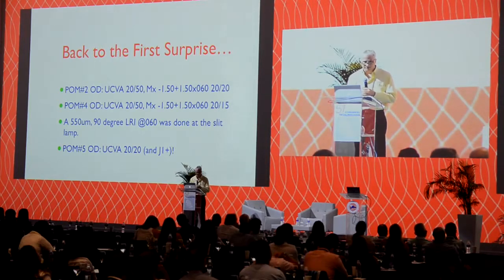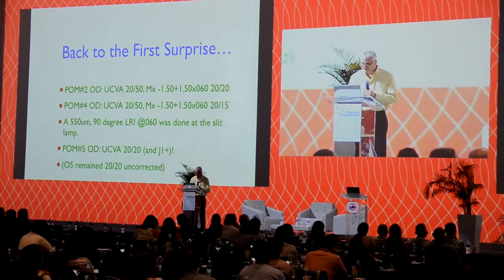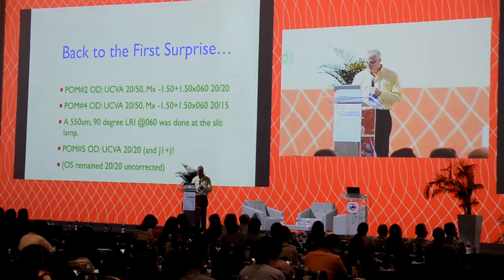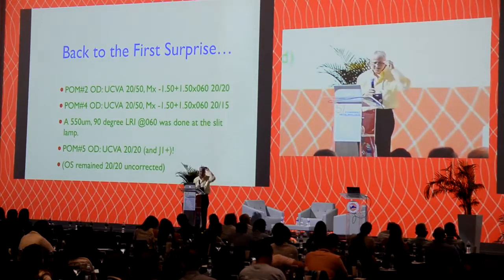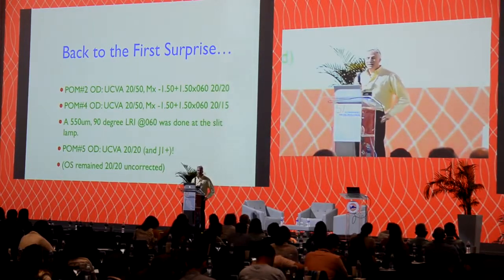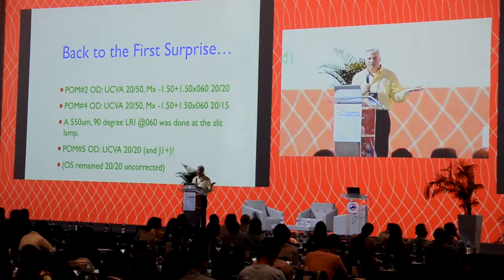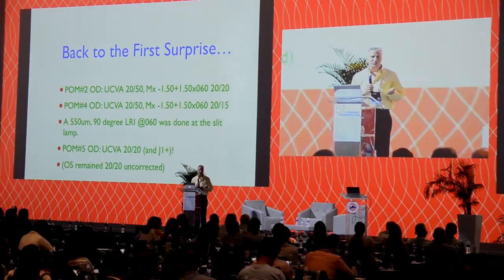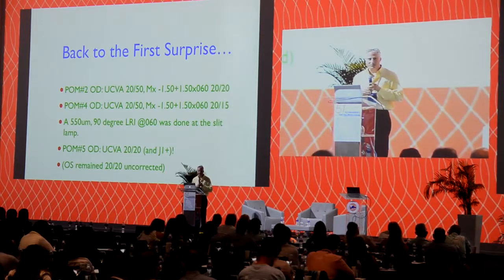Remember, this is the same implant lens. Very odd. The left eye still remains 20/20 uncorrected at 4 months out. So the interesting thing about this case, I don't have the right answer, but I picked the left eye implant lens based on the right eye outcome, and subsequently found that the right eye outcome that I based it on was wrong. But both of them stayed normal. I have no explanation other than suspension of the laws of physics to understand that.